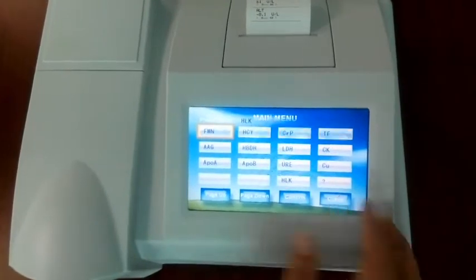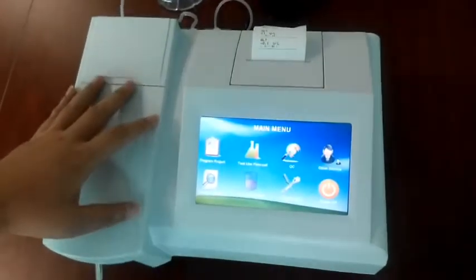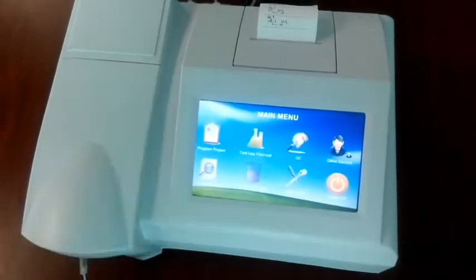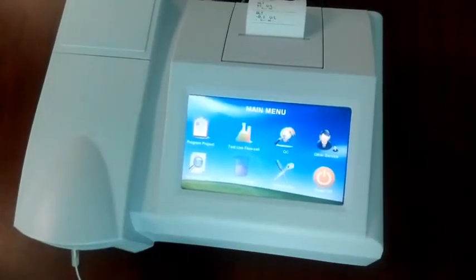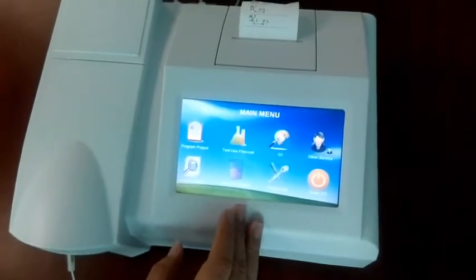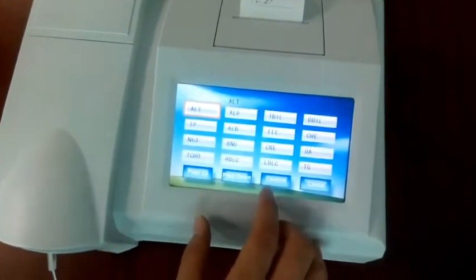There are two ways to do the test: one is using the flow cell and the other is using the cuvette. It's better to use the flow cell because it is fast and convenient. Now let me show you how to test using the flow cell.